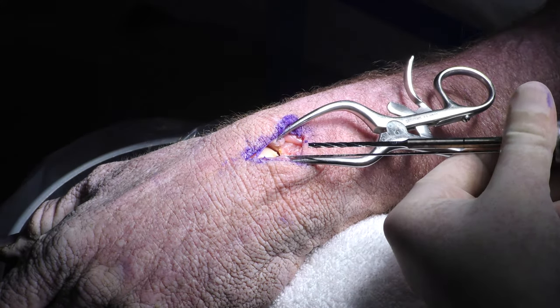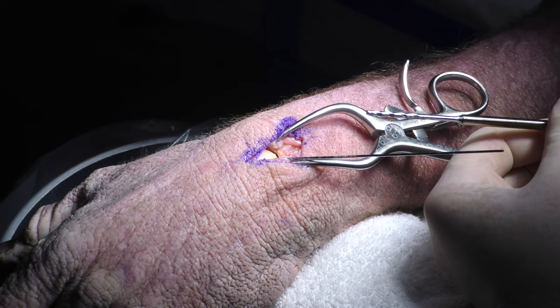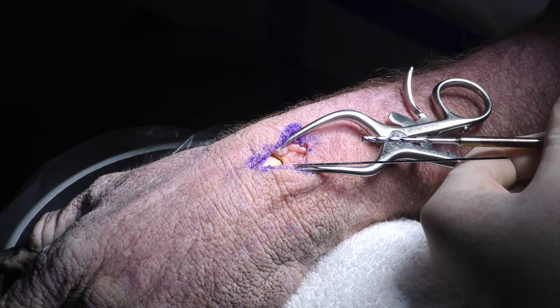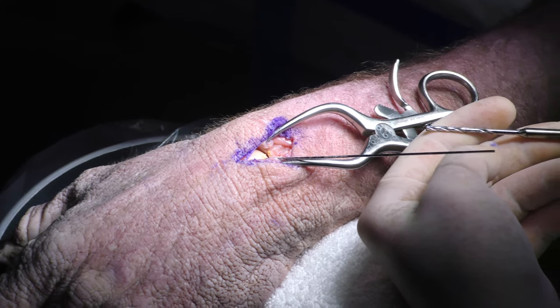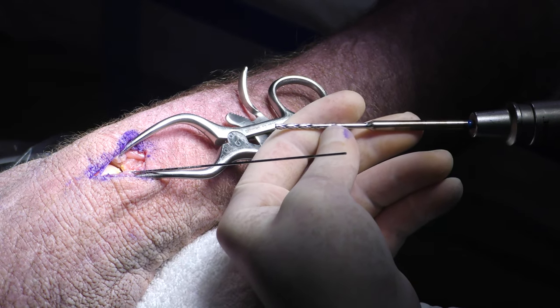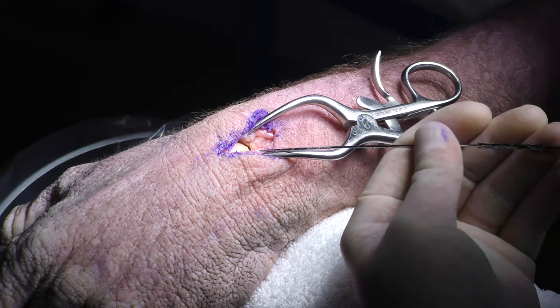So we know that this is a 20 millimeter screw that we're going to put in. And we're going to drill. The first mark is 18, the second one is 22, so we'll probably drill right in between it. You can also check on C-arm, which is again what I frequently do.